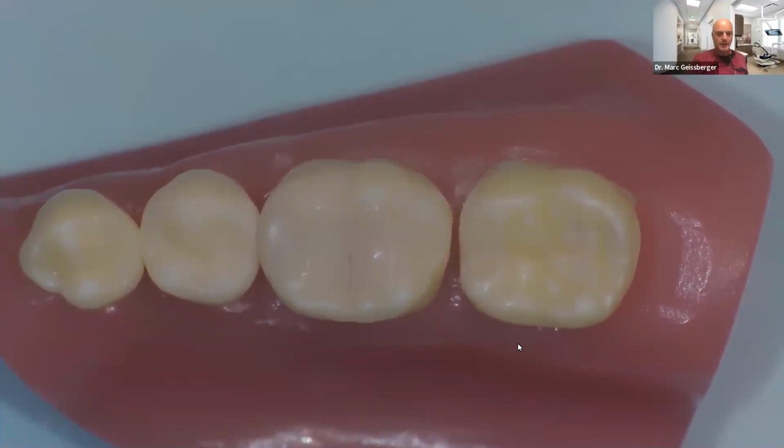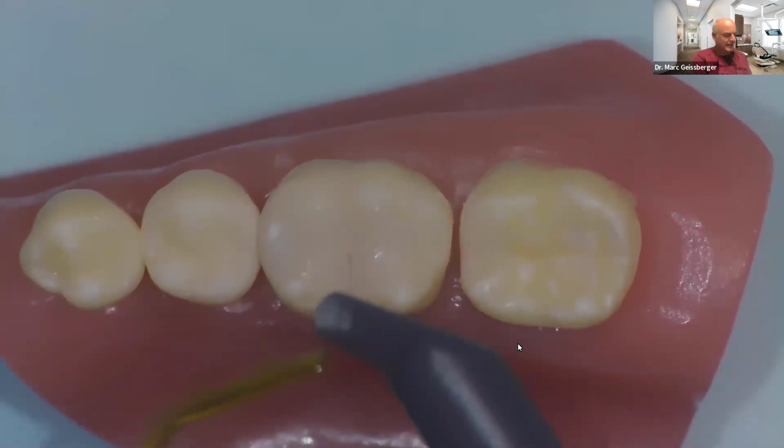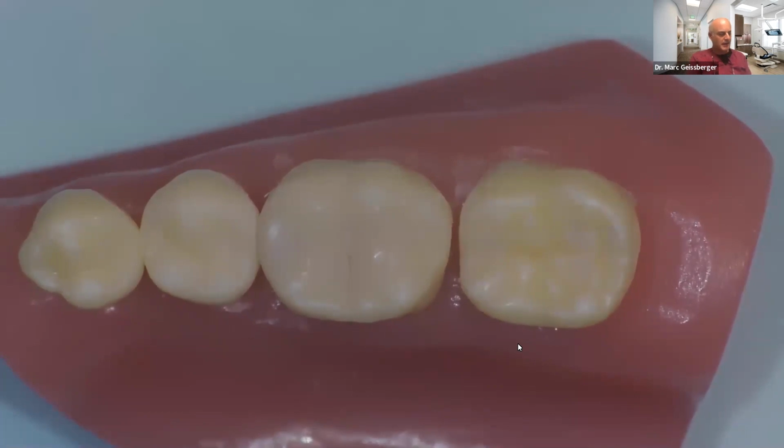When you squirt composite into a box form and somehow kind of tear it off, you run the risk of creating little shards on that composite. And that's what I think leads to a lot of voids in the composite. The other thing is, if I'm going to wait till the end to place it, I've got to be standing by with my composite gun and then waste time. So by using the time my assistant is curing it to come in here while she's curing, express exactly what I think I need, cutting it off allows me to place precisely the amount of composite, precisely where I want it, without incorporating any voids. And I think that really helps with the overall clinical results.